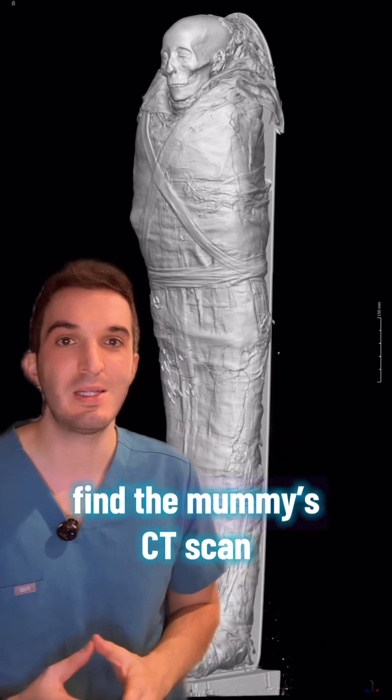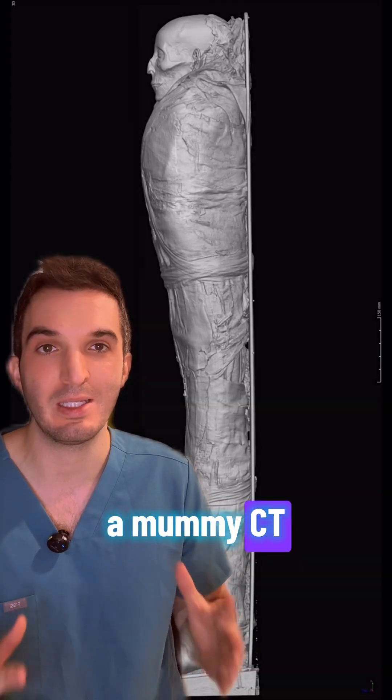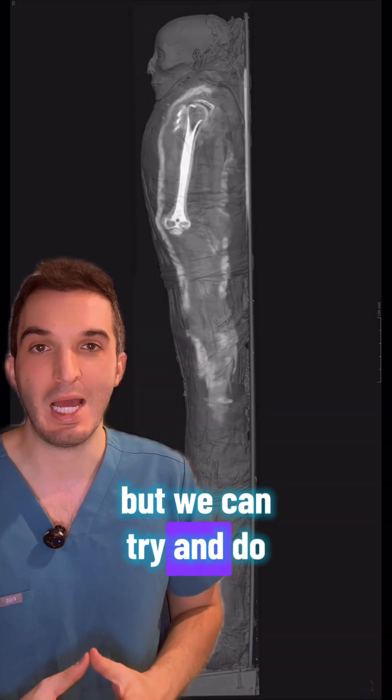The good news is I did find the mummy CT scan. The bad news is I have never trained on how to read a mummy CT, but we can try and do our best.